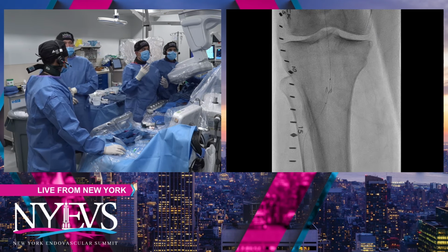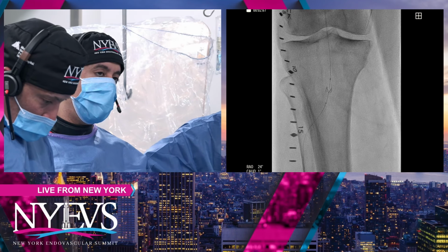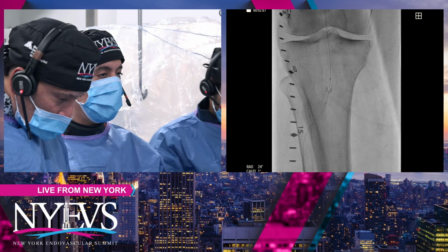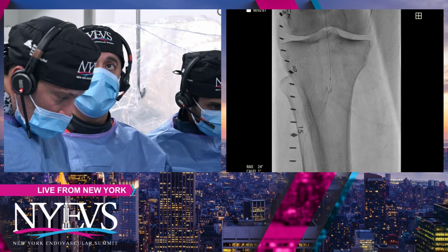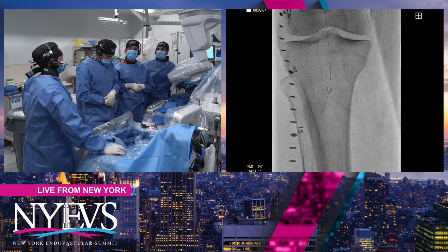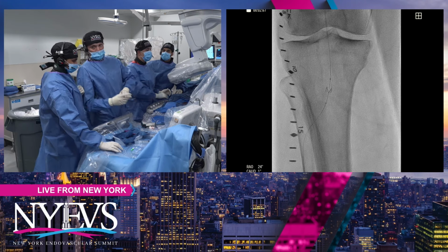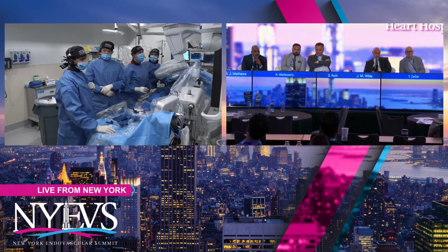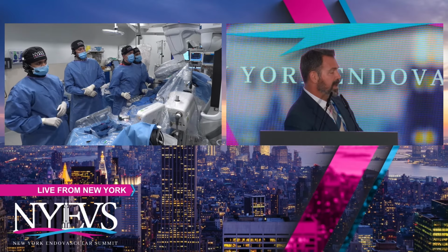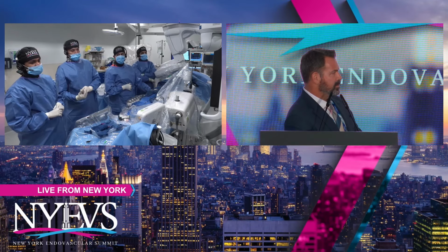Okay. But what about the thought process on fixing that middle segment? Do we do another Zilver? Do we do another short Supera? I think most of us were saying another stent. Now the stent choice we didn't really decide on. I would just put a short 6 DES. Yeah, DES. Short 6 DES seems to be the consensus, 6 by 60, for both the mid and the proximal segments, with overlap. And then proximally, whatever size you got on IVUS, you put a DES there.